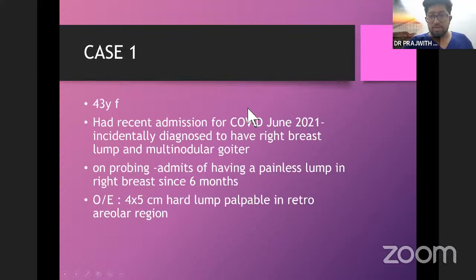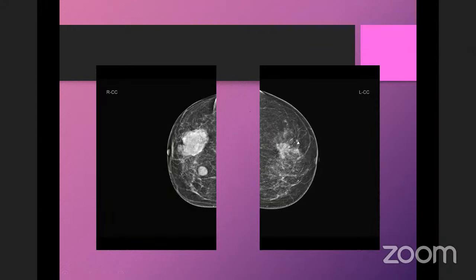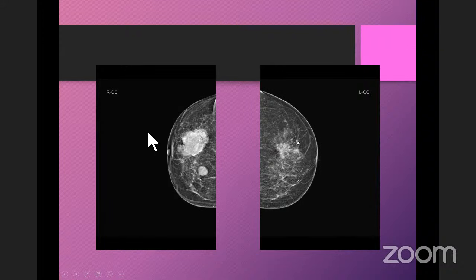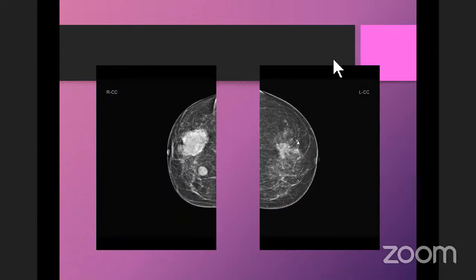Dr. Prajwith, can we discuss some case scenarios, please? Yes, I have case scenarios. I'll show the case, but someone will have to volunteer. If someone can volunteer for this case. I request Dr. Abib Shah, exam going PG. Please raise your hand who is ready. Just give an attempt. Are you ready? Whatever you can see. Yes, Abhiksha is there.